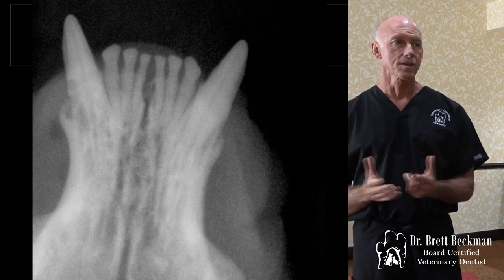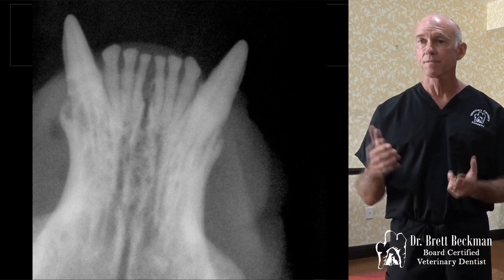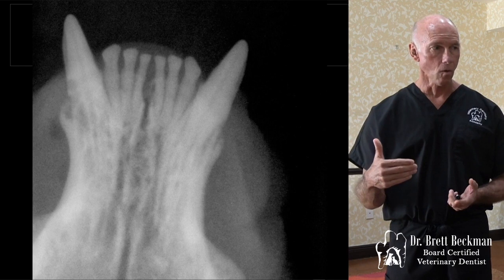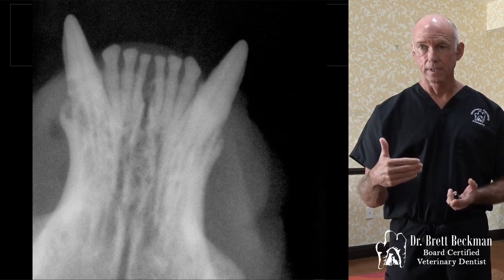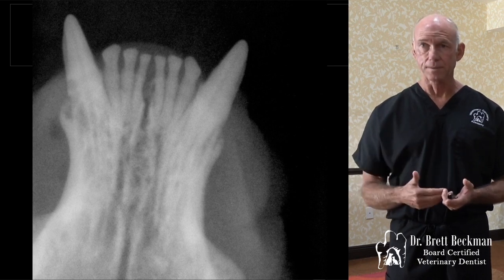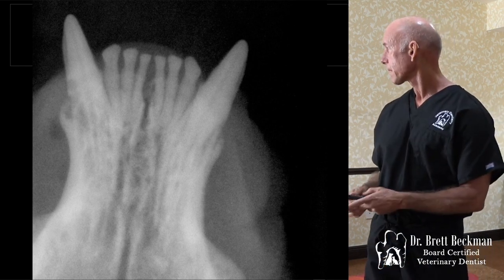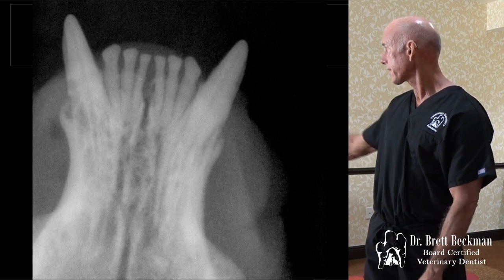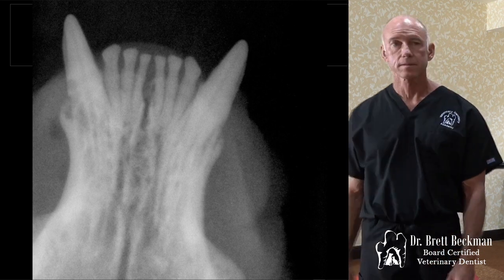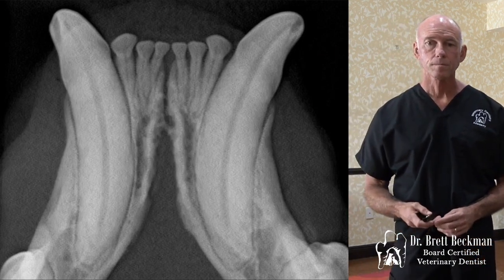Always do your normal approach for these canines, whether it's upper or lower, because you're still taking the crown off, and you still have to get the gingiva over to cover the hole. So you're going to need a flap, usually as big as you would need for your normal extraction. You definitely take the bone down to here. This is another one where you've got a little vestibular bone expansion, but that's probably all you need on that, versus normal.